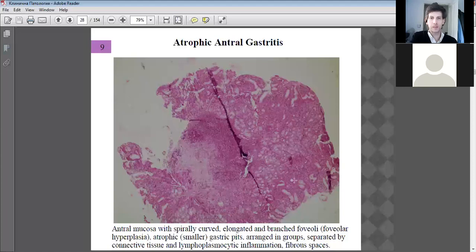But what your professor is trying to say is that the groups of sections in the tissue are separated. So this is a section here, another section there, separated by connective tissue. Some good connective tissue there. But the atrophy means that the number of functional cells decrease. So overall, there's some areas like this area here where there's fewer functional cells left. Okay, and smaller areas where secretions are produced.